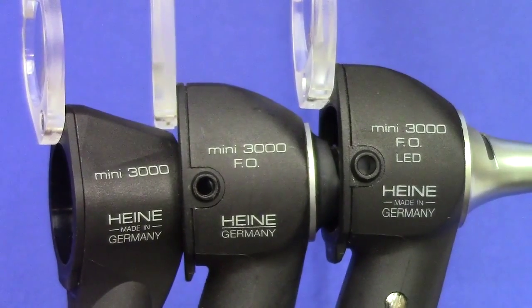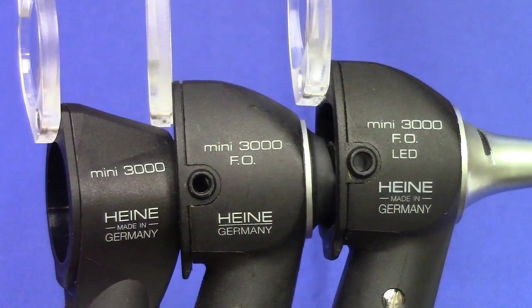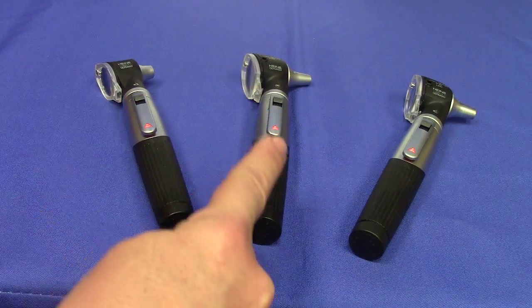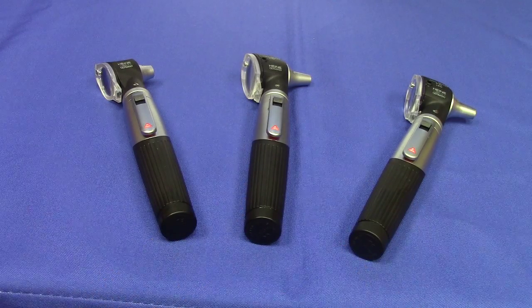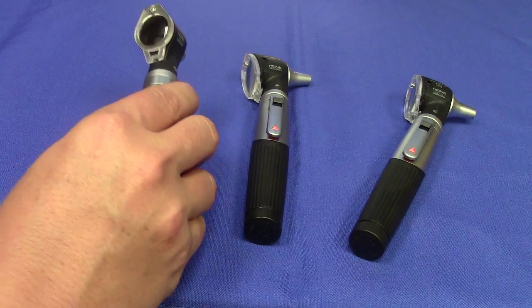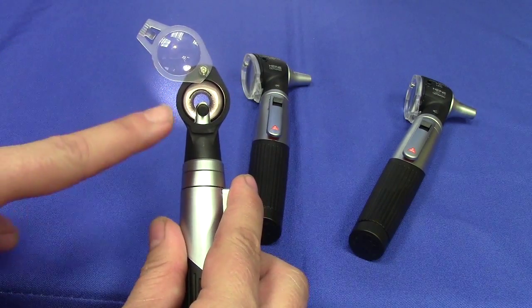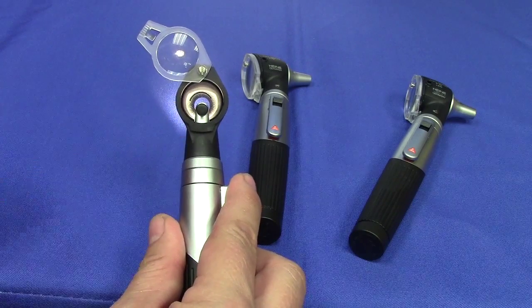Now that you can quickly tell the difference between the three models, let's talk about how they actually differ from one another in terms of features and benefits. The Heine 3000 non-fiber optic pocket otoscope differs from the two fiber optic models according to how the otoscope directs the light through the speculum. The non-fiber optic otoscope uses an older form of illumination technology and shines light directly through the speculum. Because of this, the otoscope bulb has to be located in the eyepiece compartment and right in the middle of the visual field.